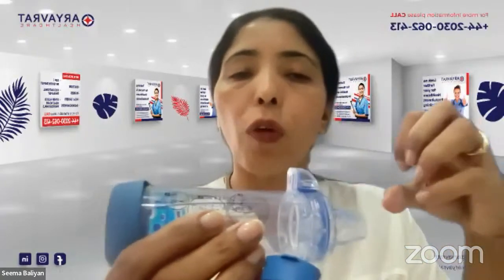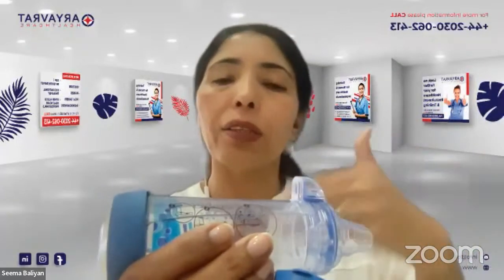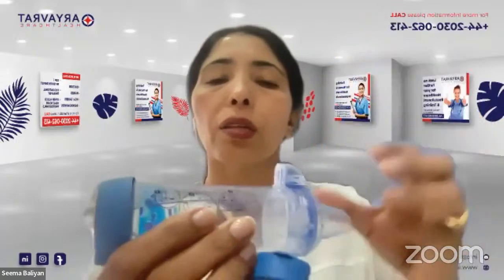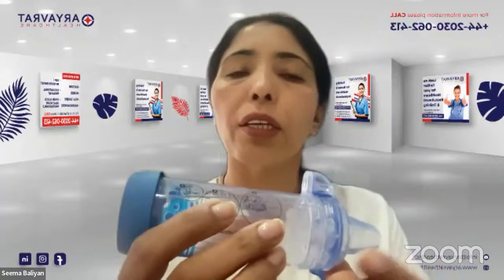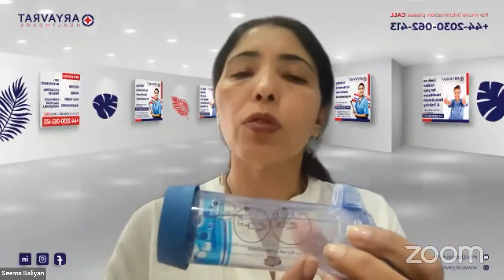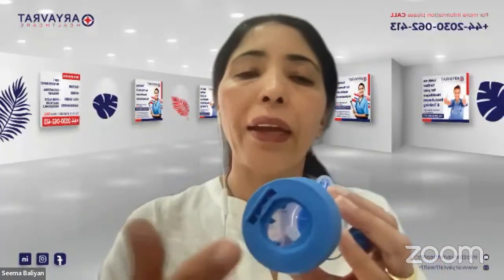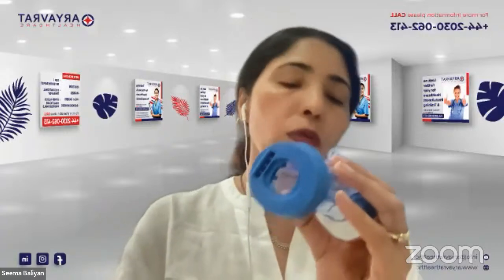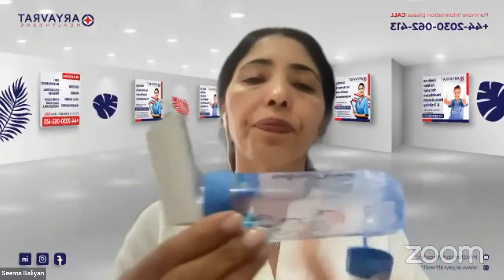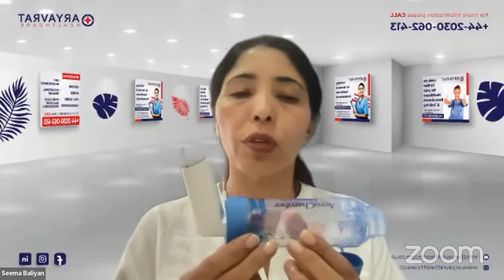It is a one-way valve so that you can take the medicine out, but your breath when you are exhaling is not going to go inside. It will come out through the vents over here. So it becomes easy, without diluting, you are taking the medicine out from this one. And the medicine is going to be stored in this chamber till you have actually taken the medicine. In the end, there is a slot where you are going to be putting your inhaler. So it is going to be slotting like that. So this is how your inhaler and your spacer are going to look like.